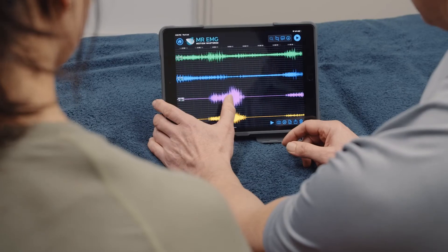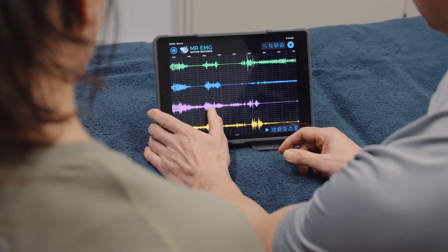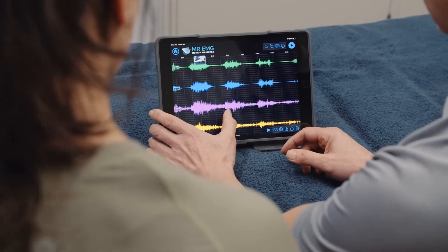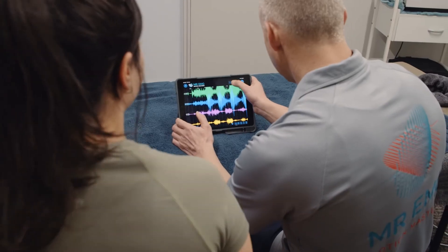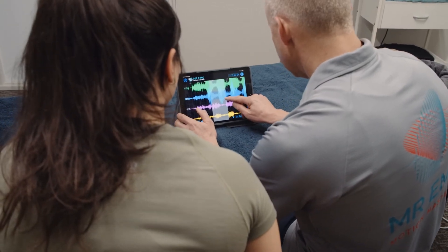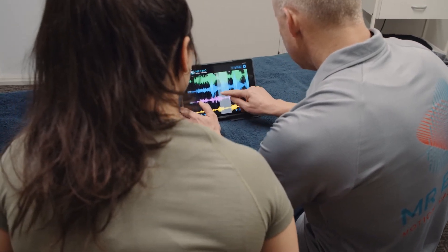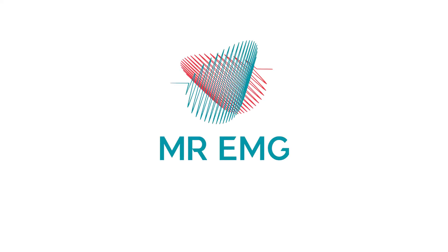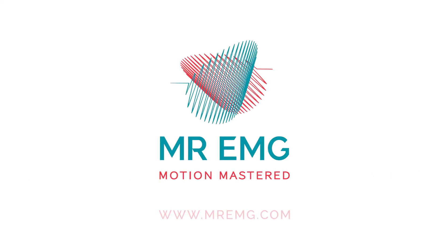To conclude the assessment, we recommend you sit down with your subject and analyse their data, identifying any muscle inactivity during movements you feel is related to their symptoms. We hope you enjoy using Mr. EMG.